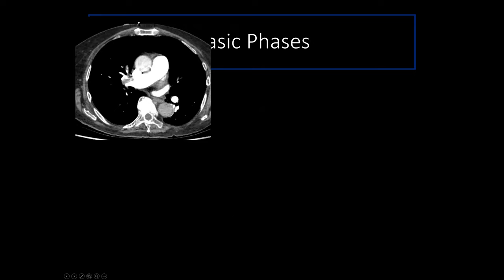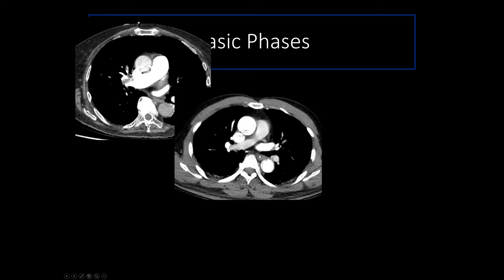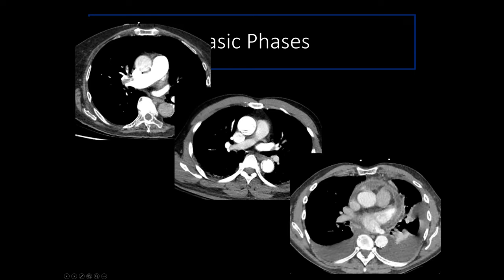Pulling up images: at 15 seconds post-injection, contrast is in the pulmonary artery — this is a CTPA. You'll pick up PEs very nicely as dark filling defects. In the middle image, the pulmonary artery is less dense but the aorta is very bright — this is a CTA. On the bottom right is a routine contrast-enhanced study where the arteries aren't super bright but you can see enhancement of structures like the pericardium. Now you understand why each phase looks the way it does.